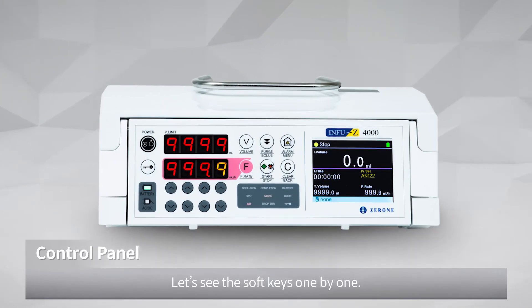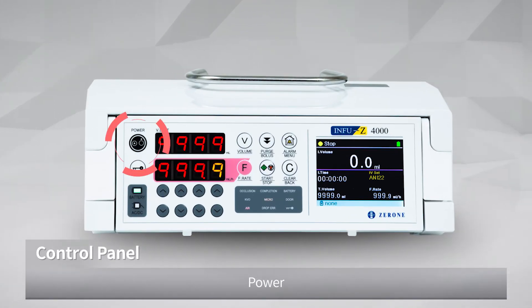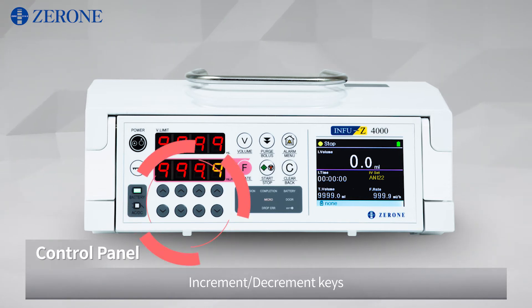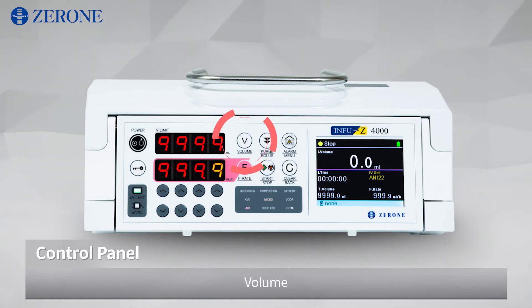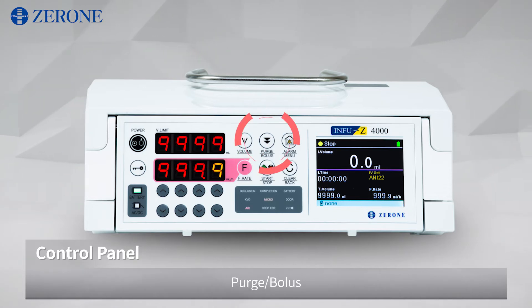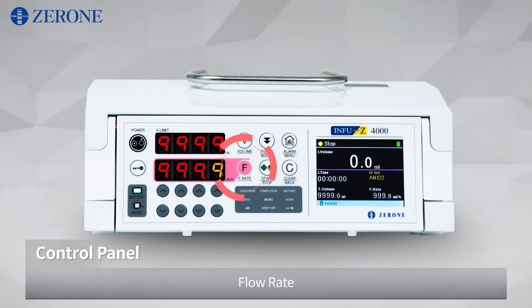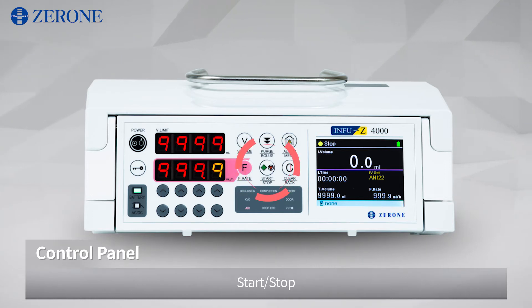Let's see the soft keys one by one: power, key lock, increment, decrement keys, volume, purge, bolus, alarm, menu, flow rate, start, stop, clear, back.